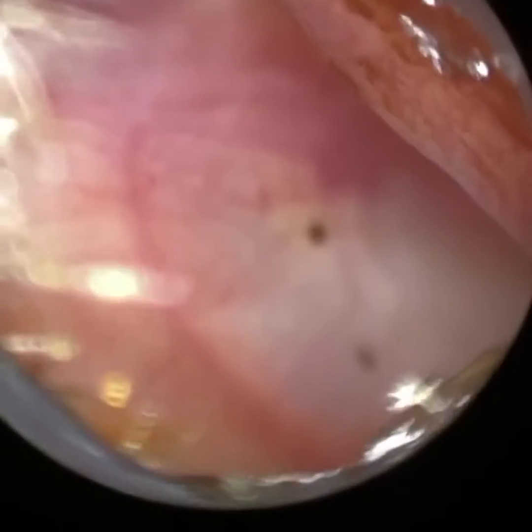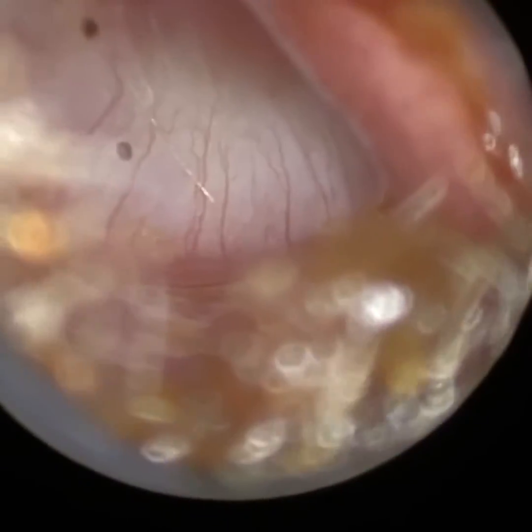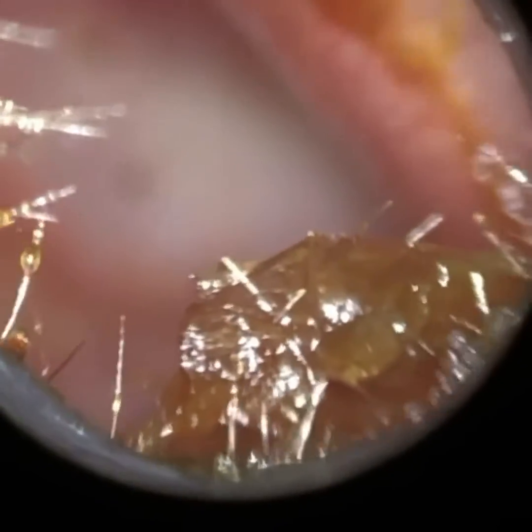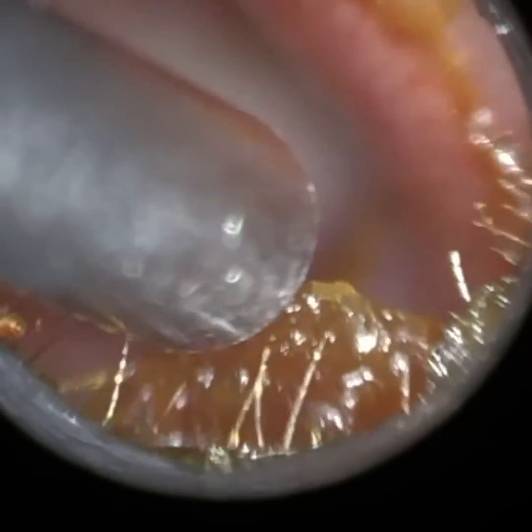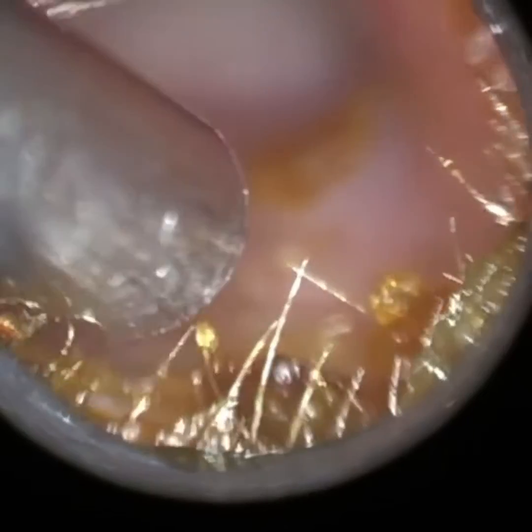There's some lateral dark sticky wax there as you can see. And beyond the wax, although the tympanic membrane is visible — you'll see that in a moment — there's just some residual wax at the base of the ear canal, some keratin actually. You can just see how clear the image is, including of the suction probe. There's no distortion and it's all in focus.